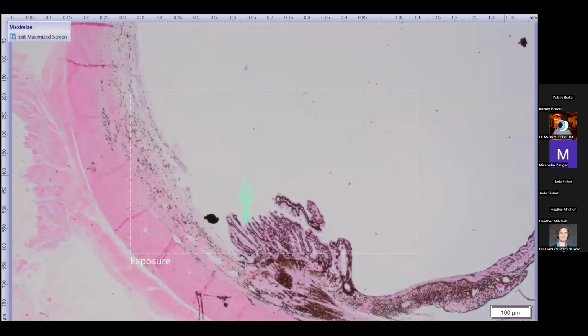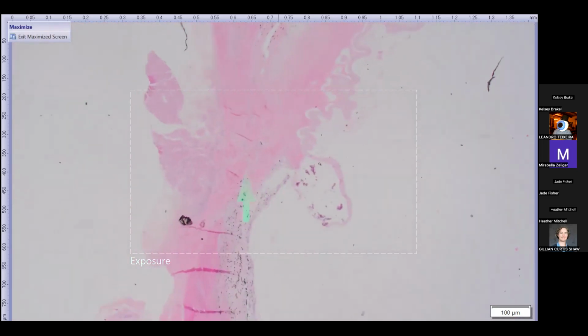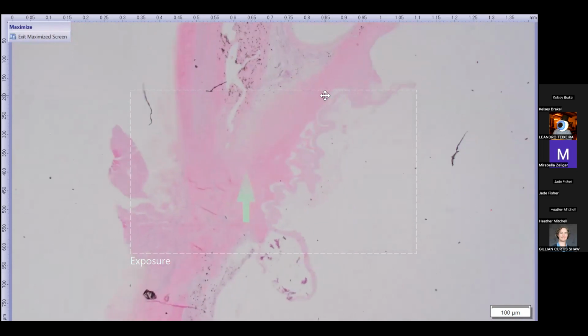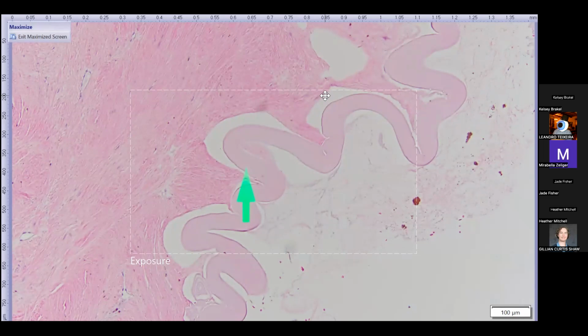In addition, if we go back to the big scleral rupture here, we see something that we've been looking for a while. We have this nice dense collagen of the sclera, but it just sort of peters out. And we have this more disorganized collagen of the fibrous tissue and this tightly fused orbital muscle into that site of scleral rupture. But we also have fused into this fibrosis in the posterior globe this extremely crinkled up basement membrane collagen, nice and homogeneous. And this is the lens capsule. So we have a ruptured lens capsule that is fused to this site of rupture in the globe.